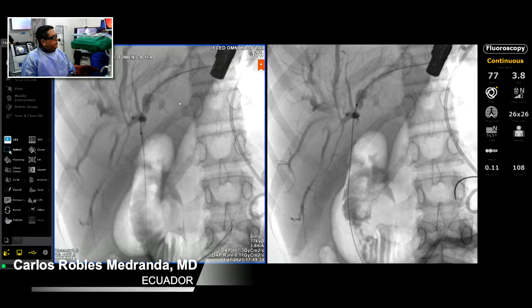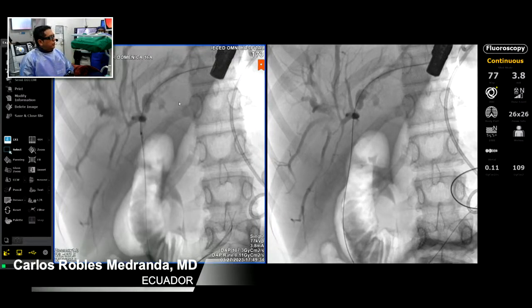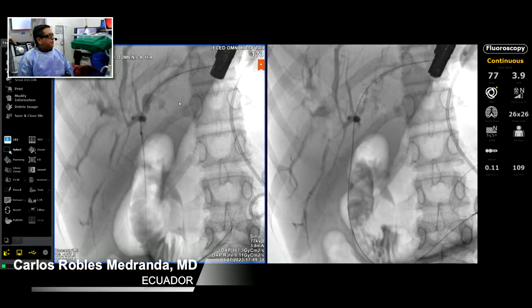So we arrived to do the communication between the right and left, and then by accident, we fell. No. The technician was not the technician. Very nice case. Really very nice case. So now we need to do a calibration. Voy a usar solo una prótesis de 7. O sea, de 7 por día, ¿no? Sí.